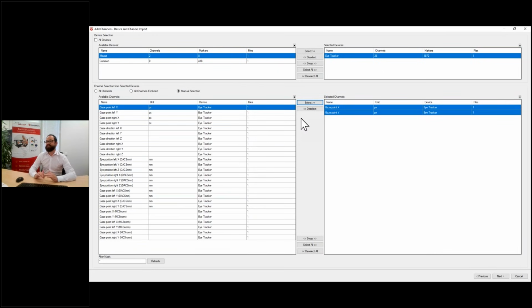Those are the gaze point channels X and Y. This gives me the X and Y positions of the gaze in pixels on the screen. I want to import this as a proof of principle, because I can look at these gaze point data together with my frontopolar channels, where I would usually pick up ocular activity in the EEG, and see whether this matches.